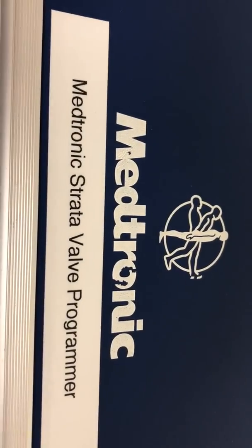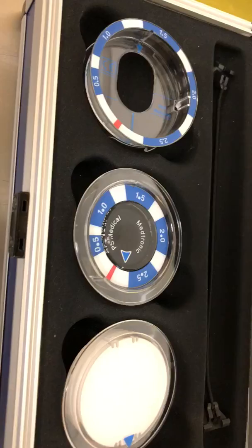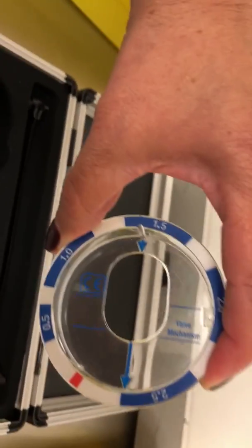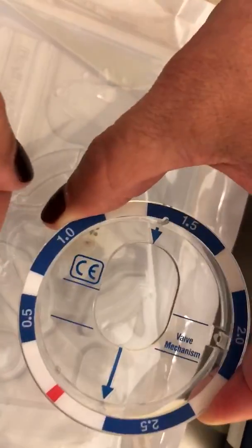This is how we program a Strata valve. You take it out of the box, see the little arrow. You open the programmer and take the first one — this will tell you what it is currently set at. See the little arrow and the little arrow pointing in the same direction.